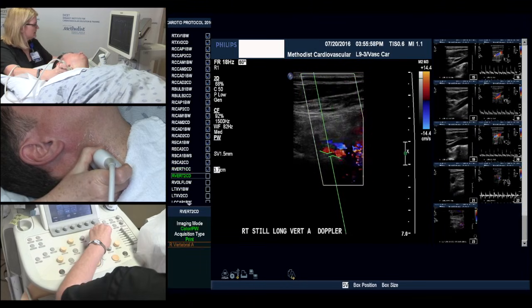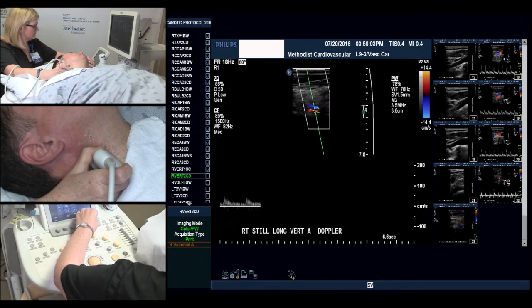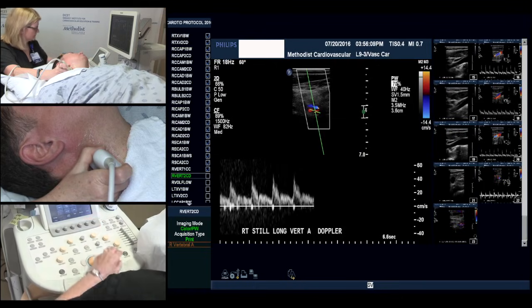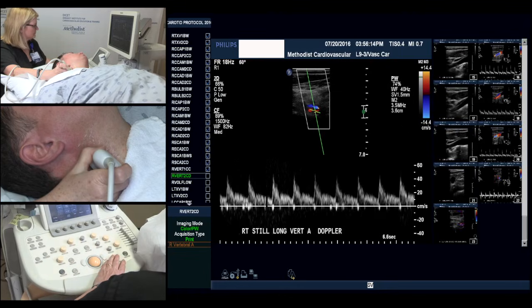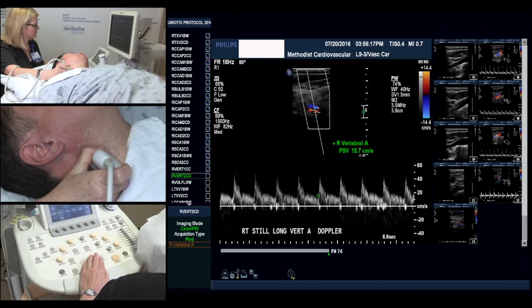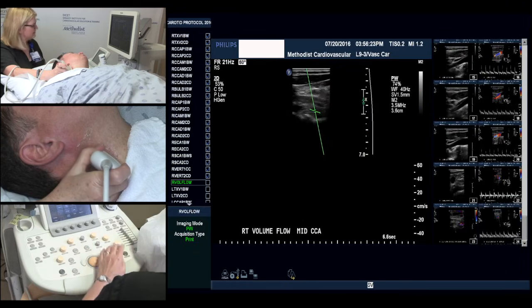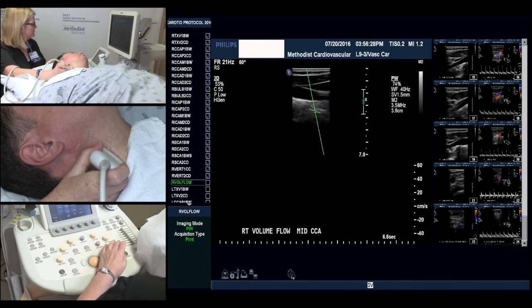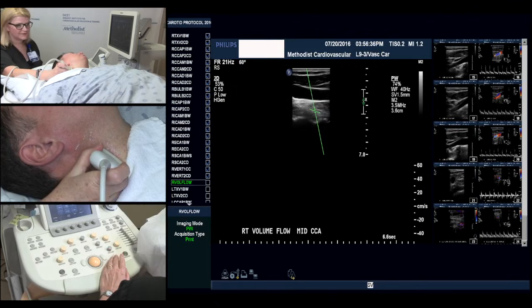And now we'll obtain our Doppler signal, adjusting our Doppler scale and measuring our peak systolic and end diastolic. If we have a 70% stenosis or greater we'll obtain a volume flow. In this case we do not have that. And this ends the protocol on the right side. From here we would go ahead and move on to the left side and go through the same protocol again.